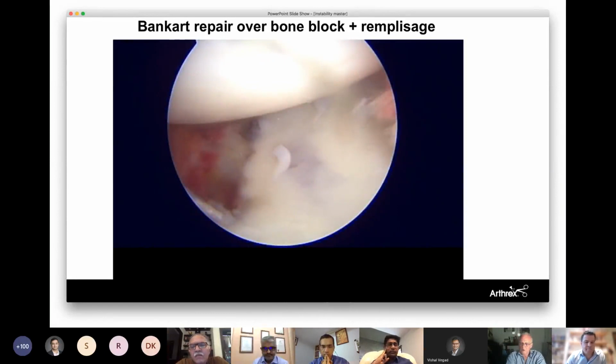But it can be done if you feel that, but sometimes you have a lot of sutures here, so it can be a little bit confusing to have like 6 more sutures around there. You can always go back and retension anteriorly anyway if you leave the sutures behind.